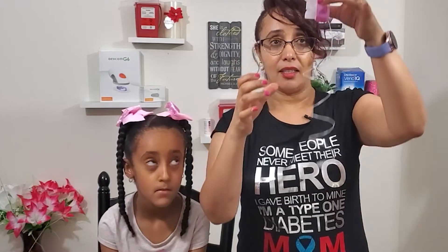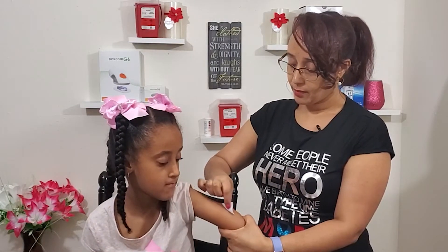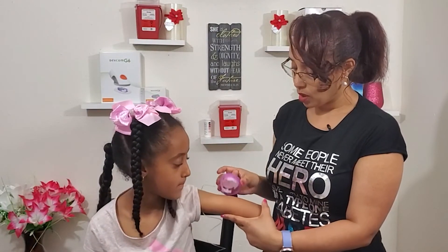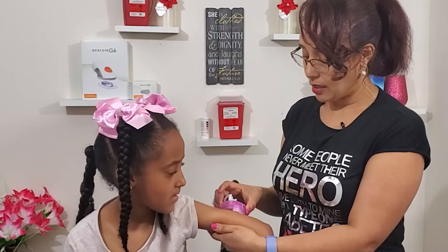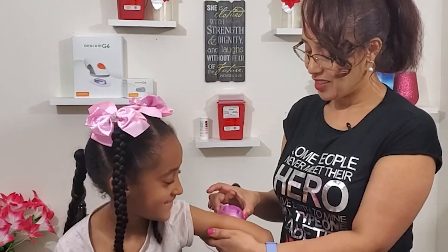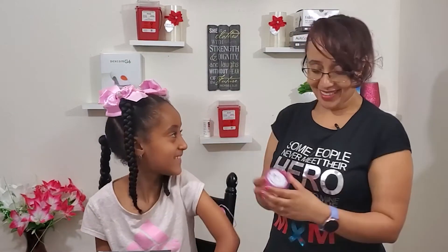If you have any injections, you can clean the area with an alcohol pad. If you do it properly, it will not be painful. You will be able to clean it.